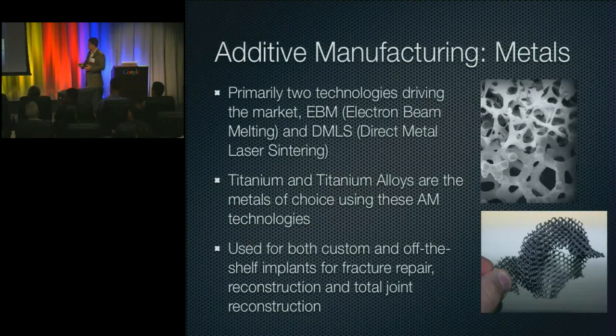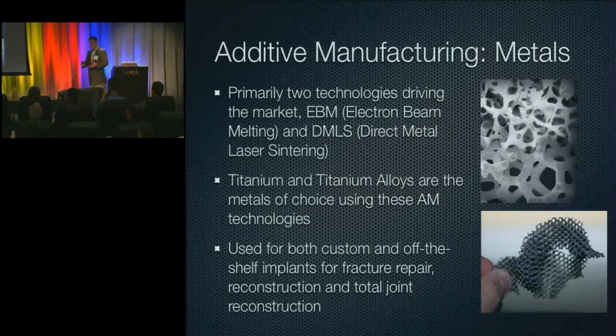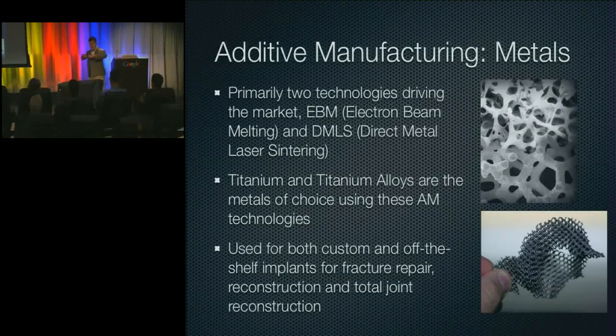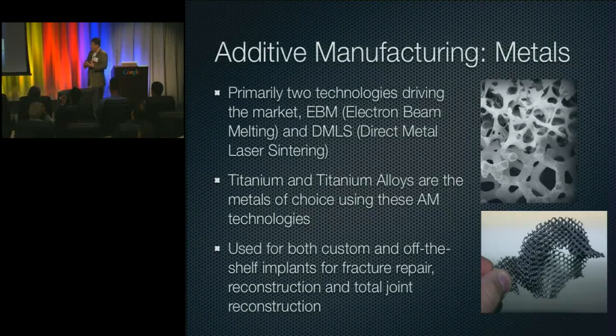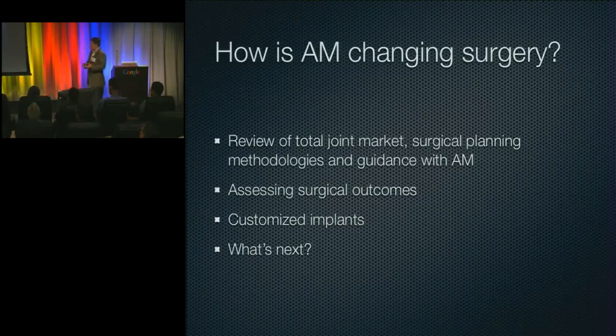And the products on the market. This is an example of the spongy bone, the trabecular bone inside the body. One of the leading products on the market that's not made with additive technology produces shapes that look like this, and many companies on the market want something that's very uniquely porous. And the body, especially with titanium, the body loves titanium. So the bone and titanium really like each other. Bone will go right up against titanium and form this bond that's great. So if you can get something that's very porous and tortuously porous, bone will mechanically lock to it, which is good.